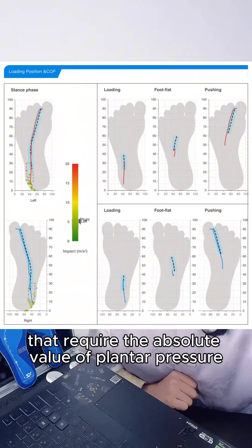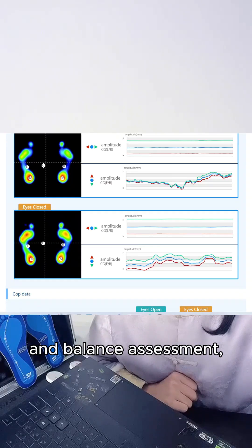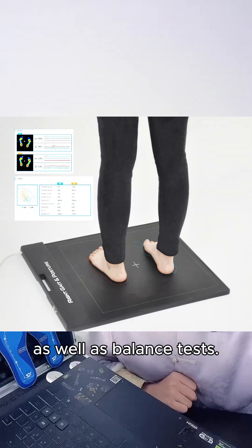For scenarios that require the absolute value of plantar pressure and balance assessment, our system can be combined with our plantar pressure plate for special static and dynamic plantar pressure, as well as balance tests.